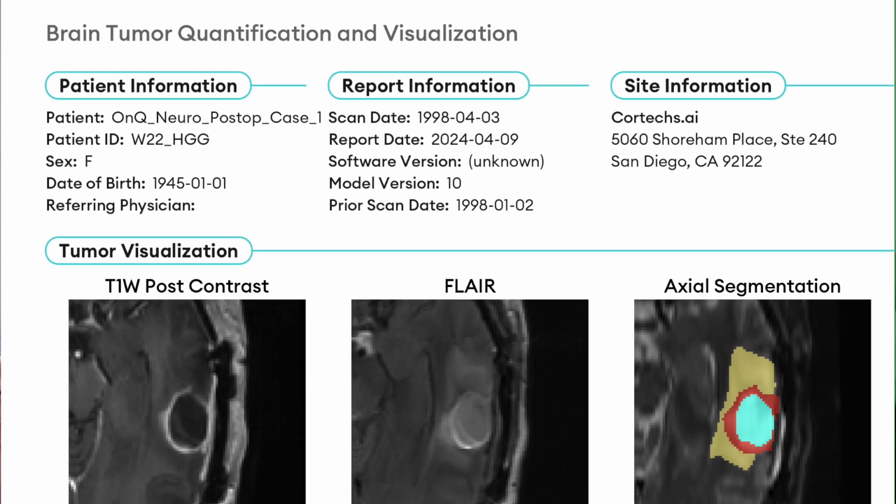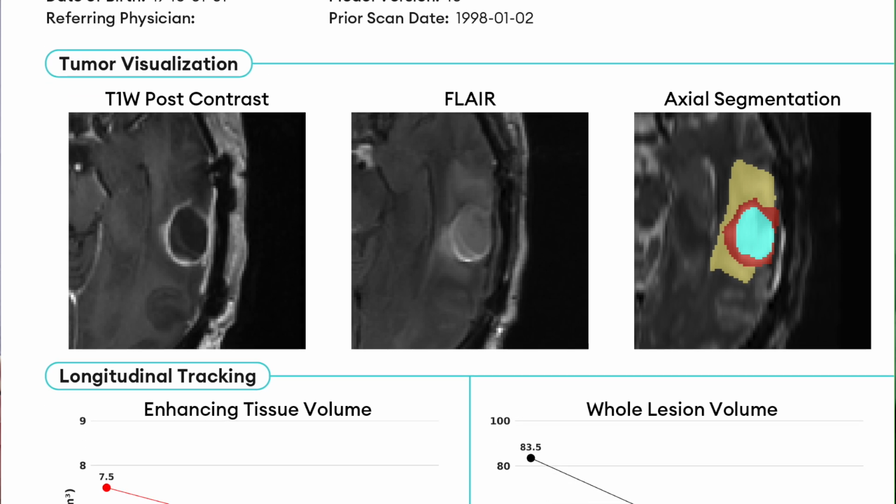And again, in the near future, moving out of just gliomas and into other kinds of brain tumors, meningiomas, and metastases, it can make the difference. It really can make the difference in a patient's life. You want to identify the lesions; in metastases, they start at like 1 millimeter in size. To be able to use automated software to detect the metastases, if you start treatment earlier, you can absolutely impact morbidity and mortality. So again, I see this kind of tool as becoming standard of care in the future.